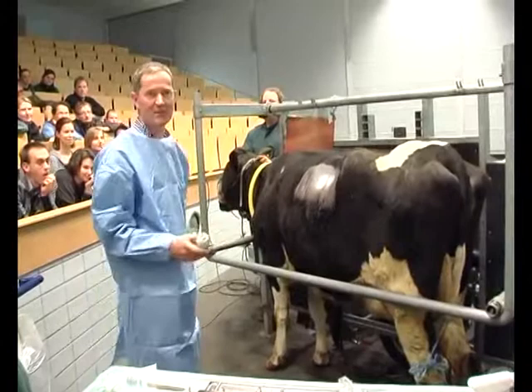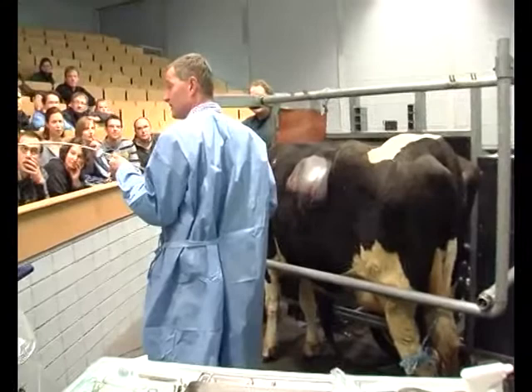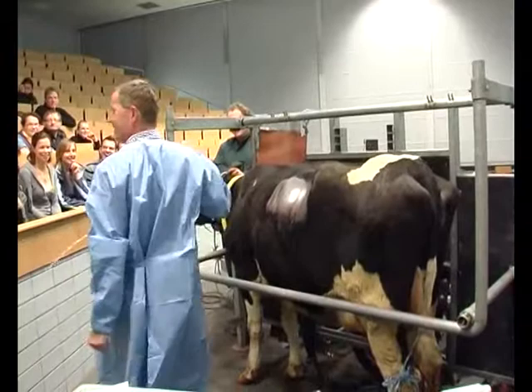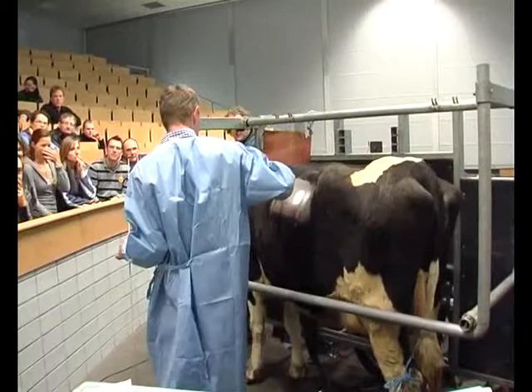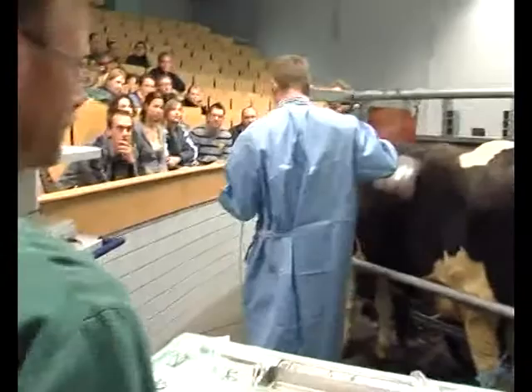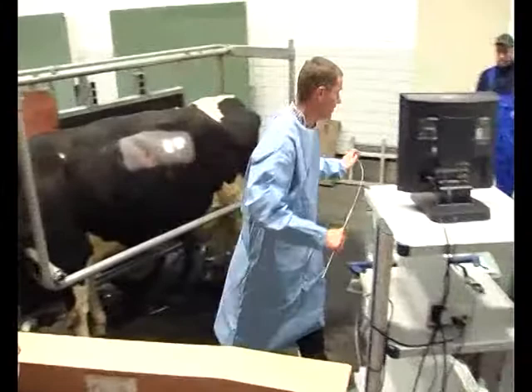For me, it's very difficult to work with this applicator. I don't know if you sell this version? No. You should not let me work with this one. If you've seen the Barizani applicator, it was a very strong, solid applicator. With a strong, solid applicator, it's quite easy to move the rumen to the other side. Now, if you push, it starts to get under the skin and doesn't pass through. This is not optimal. I think we should change the curve. Yep.